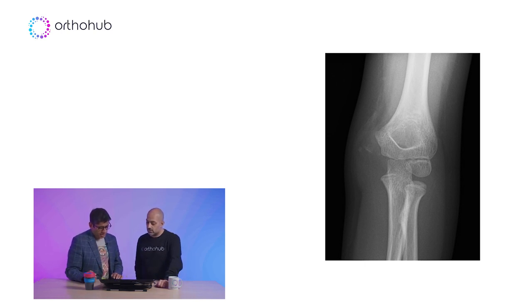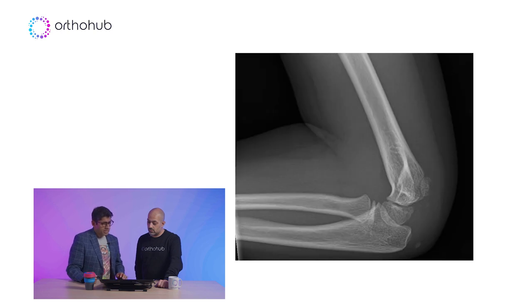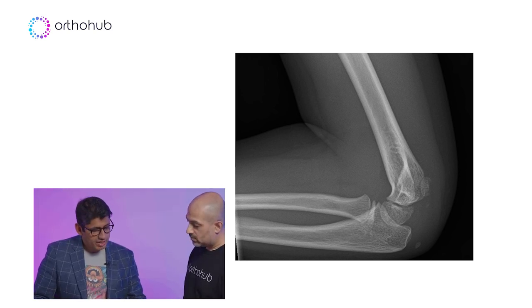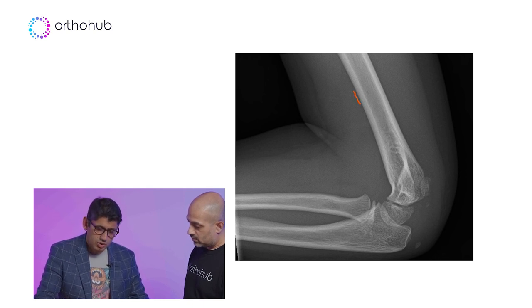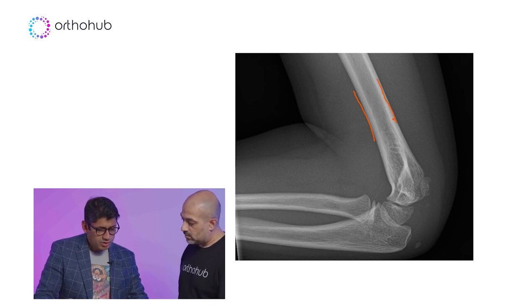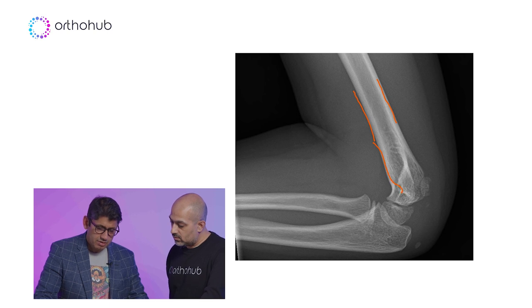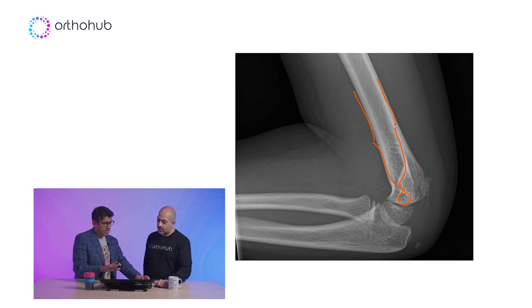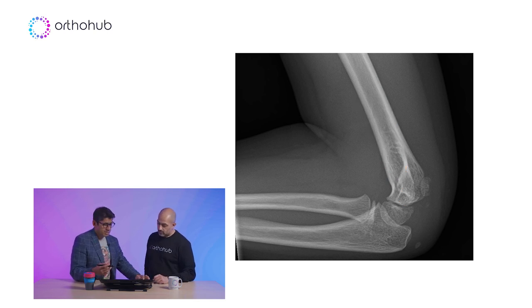So that's your AP view. Then you're going to move on to your lateral view. One of the things you want to do first is look at how well your lateral view has been taken, because that's going to influence whether you pick up some fractures or not. You want to look for your anterior cortex and your posterior cortex - you should see them converge like this into an hourglass onto the epicondyle, that'd be your supracondylar ridge. You can see here you can't see that brilliantly, so there's a degree of rotation in this one.